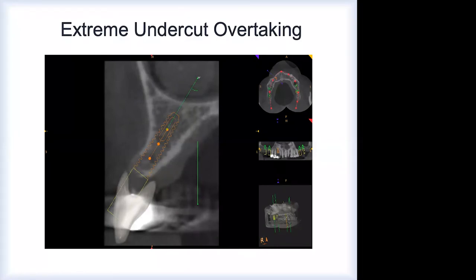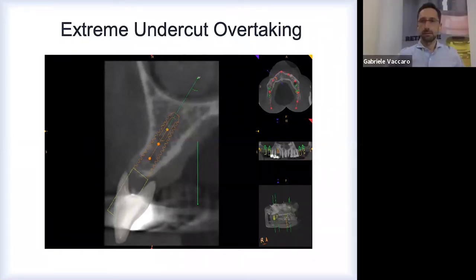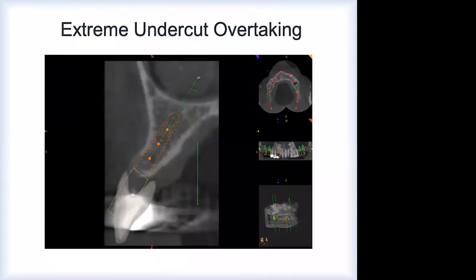I answer the question because we have a library of 1,600 different kinds of implants. Suppose the connection of this kind of implant is internal hexagon. Another one is external hexagon, and sometimes we have a trilobate or conic connection too. We have a huge number of implant types or implant brands, but sometimes we don't have some brand.